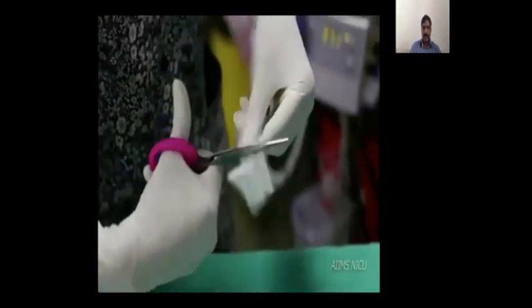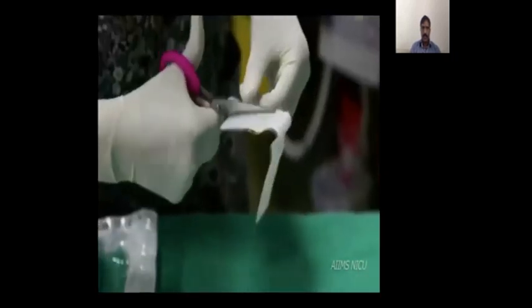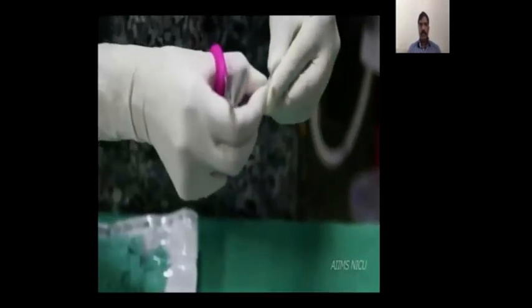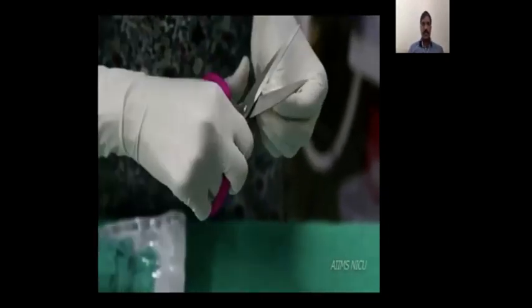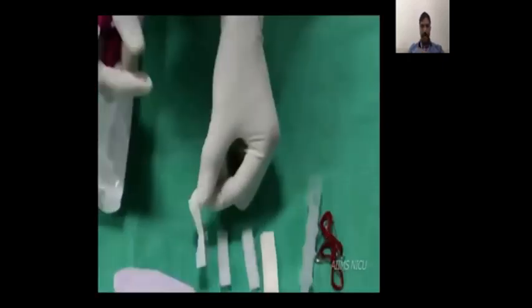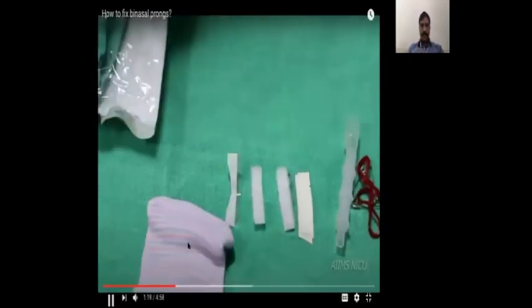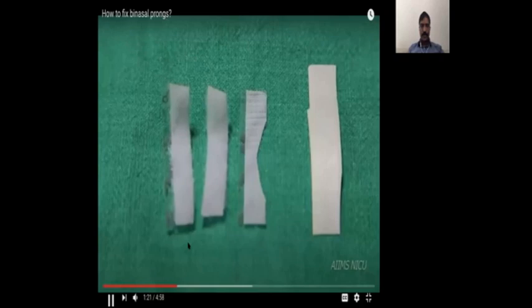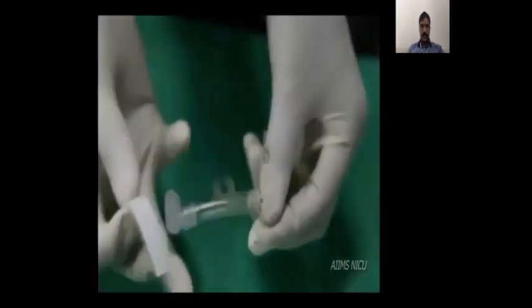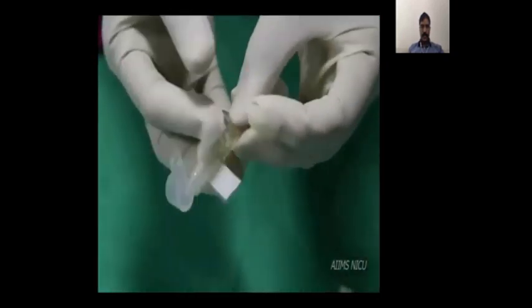Cut the rough velcro of appropriate shape, which will form the base on the philtrum. Fit the soft velcro onto the prongs on either side of the prongs.